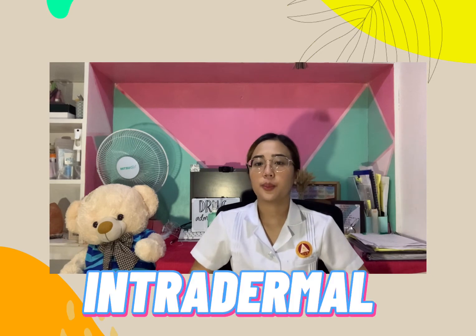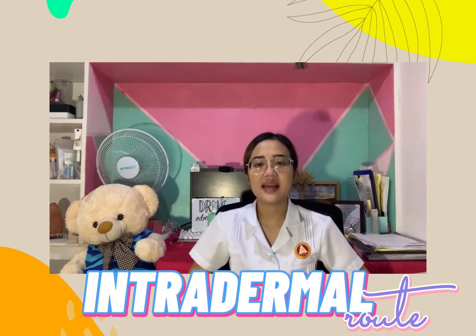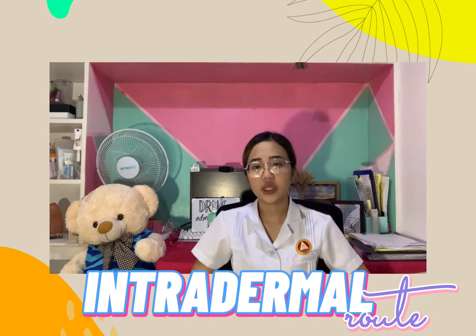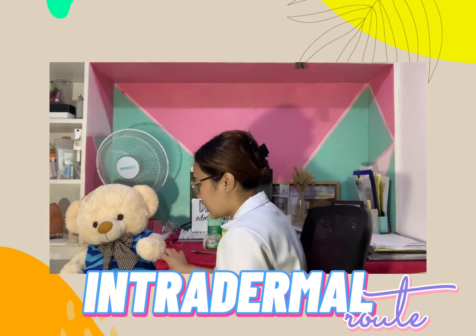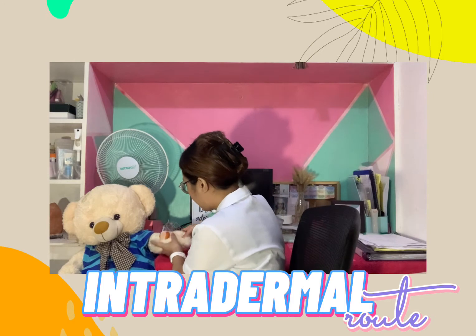So now we can perform the intradermal administration. The purpose of this is to provide tuberculosis test, skin test, and BCG vaccination to the patient. So for the assessment, we will assess the site where the skin test will be performed.